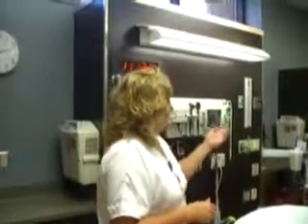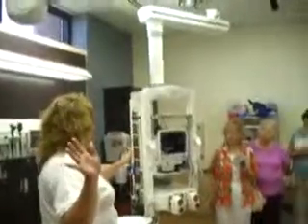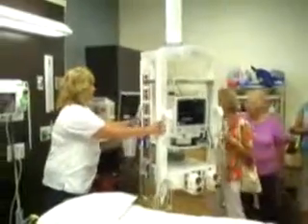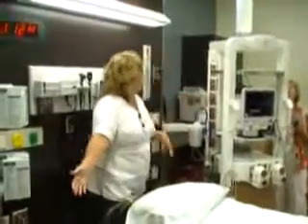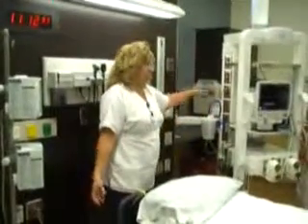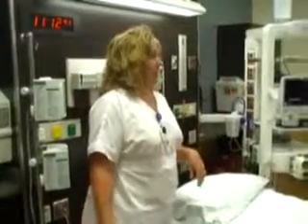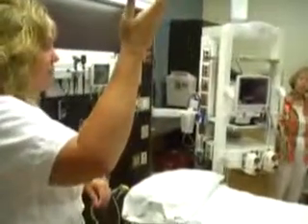Another nice thing that we have in this room is the monitoring system. The monitor is the same as the system in the rest of the emergency room, just a little bit bigger. They put this one on a boom, however, and the boom can be used anywhere around the bed that we need it to go. It's completely mobile and can end up over here if we really need it to be. The doctors and nurses can get the equipment, the suction, oxygen, the monitor, or electricity very easily at hand just by moving that. The other nice thing about this room is the lighting system that we have.